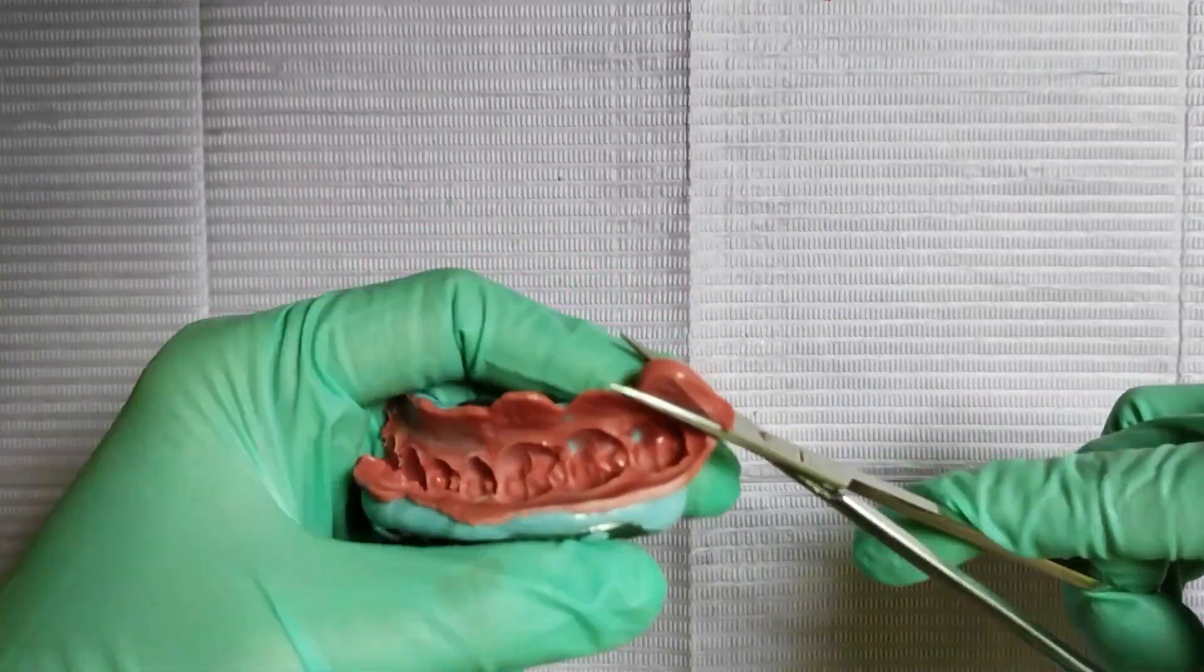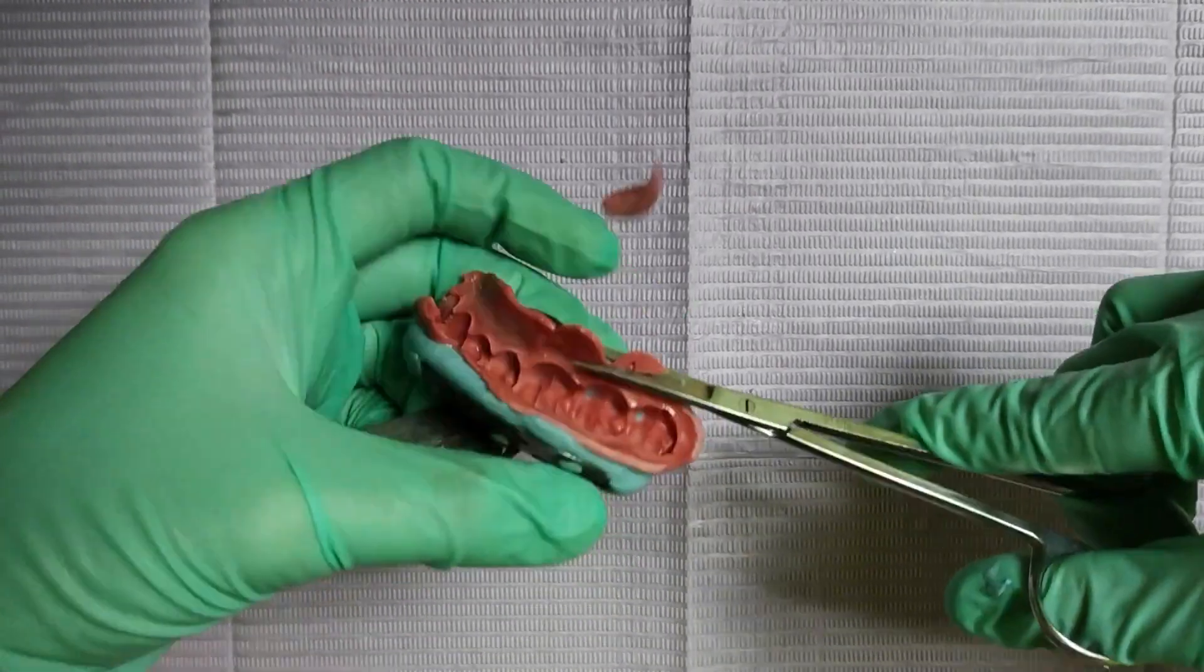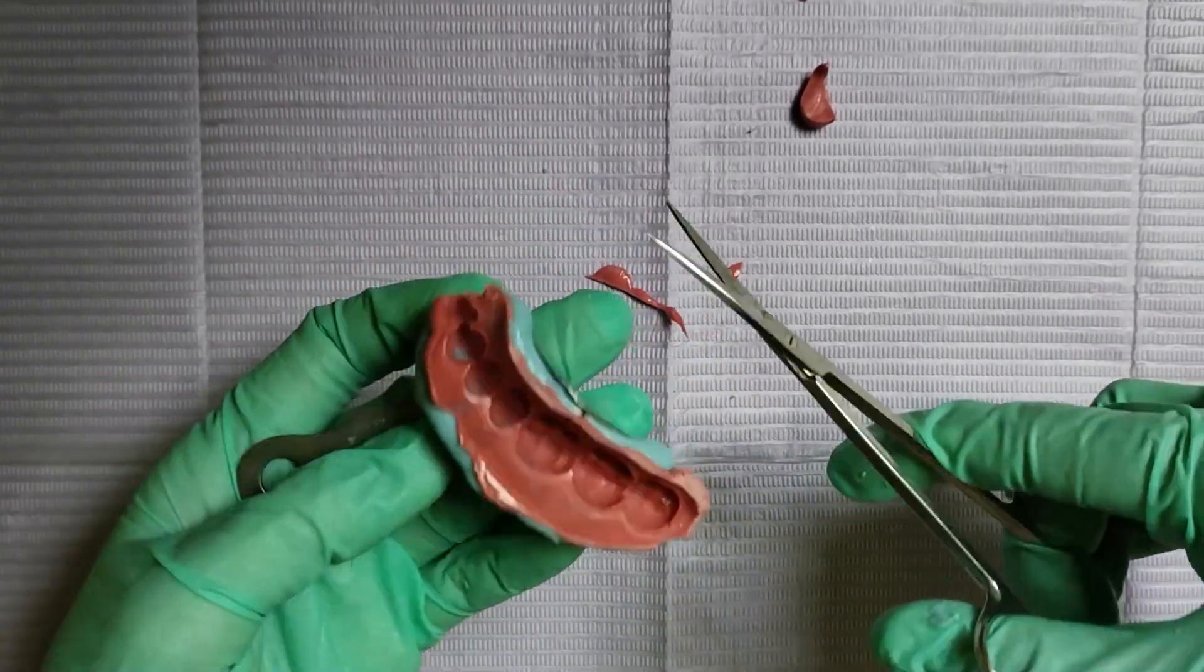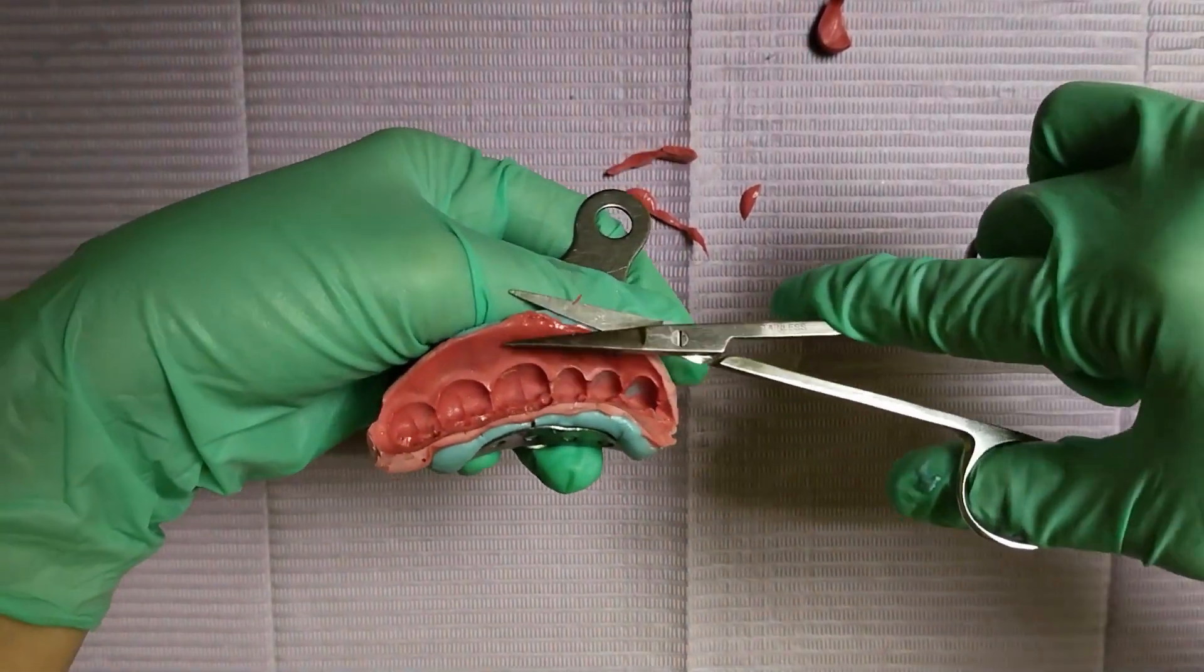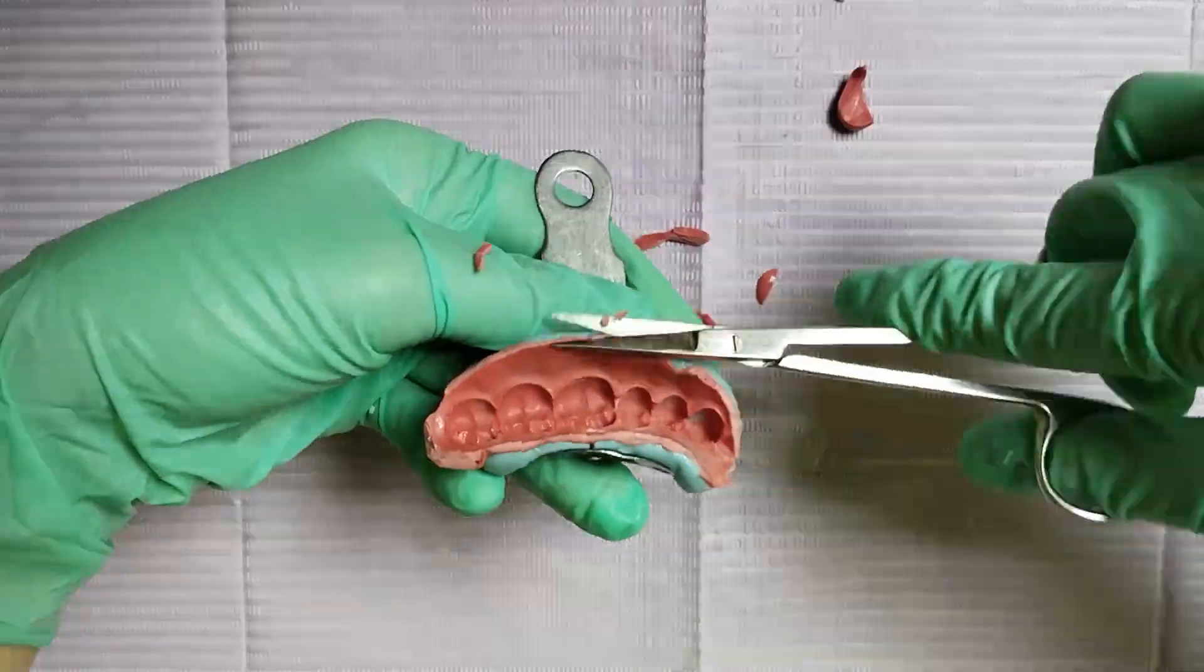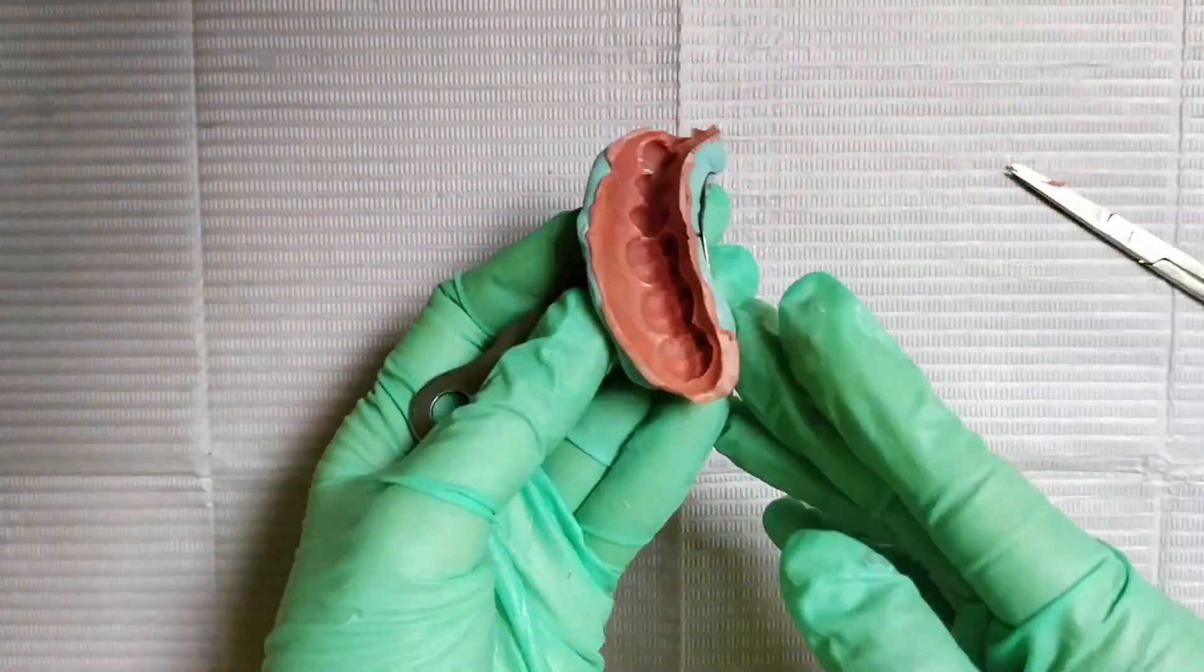After making a good impression, you can cut out the excess and make a cast using your type 4 gypsum. Use the boxing technique for making it.